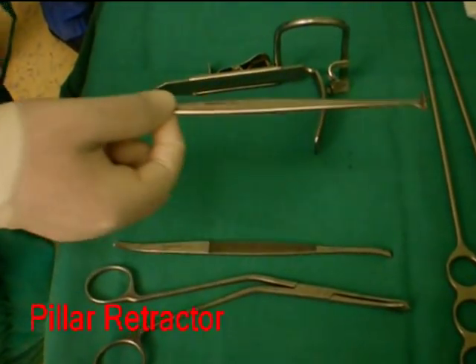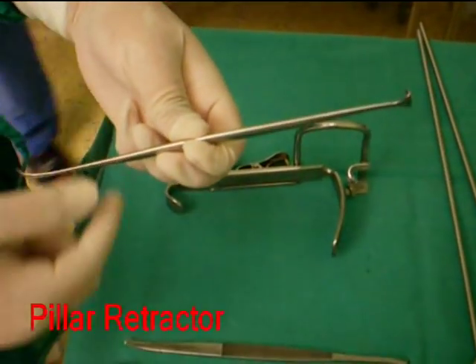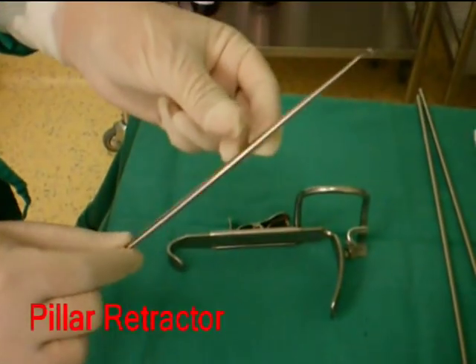A pillar retractor is used to retract the anterior pillar, mainly when securing hemostasis.